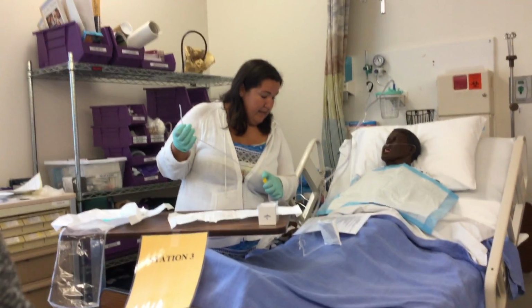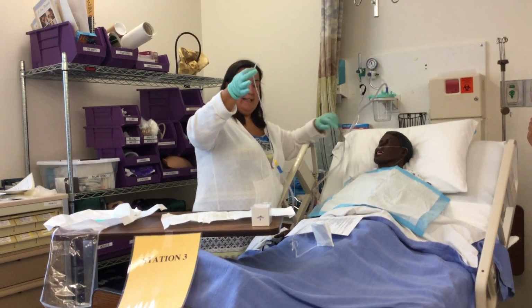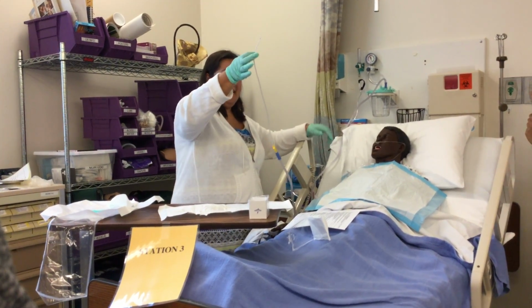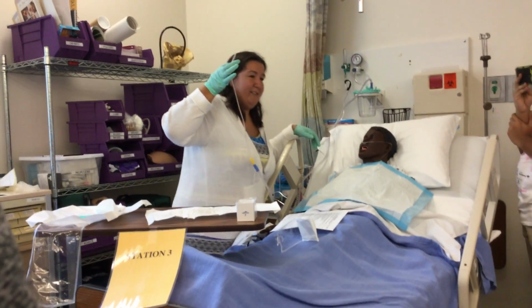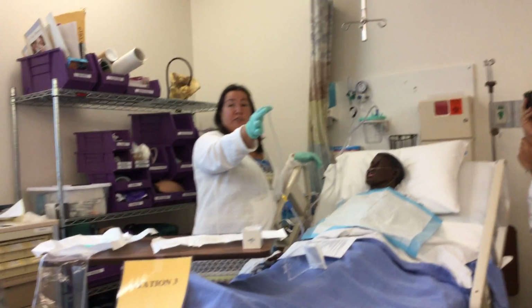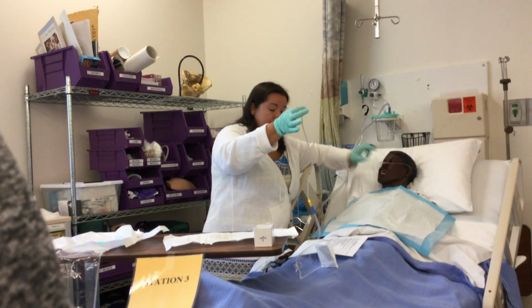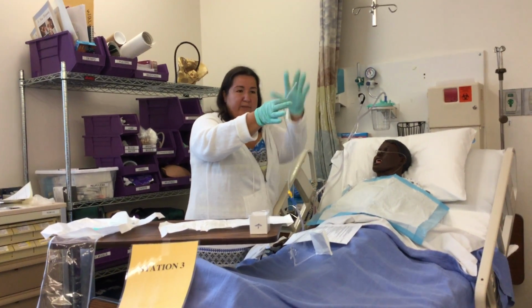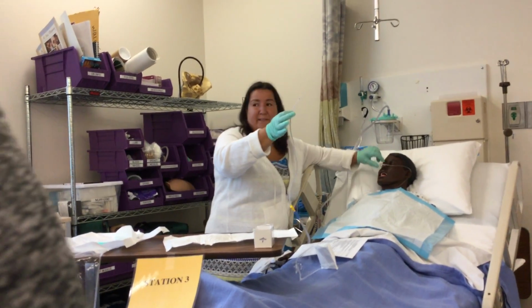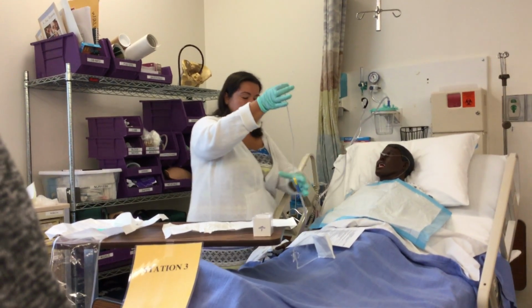Now what I wanna do is I wanna take off the oxygen just for the patient for a minute. So I like to hold it up again high. Hold it high and hold it away from you because, especially with women, if you're holding it here by the breast, they're gonna contaminate your catheter. So just hold it kind of away, where you can't get into trouble with it. And down here it's not sterile, so this is not a big deal. You want to keep this part of it sterile. So if you hold it up, that part of it's not going to get contaminated. You want to just kind of pull that off.